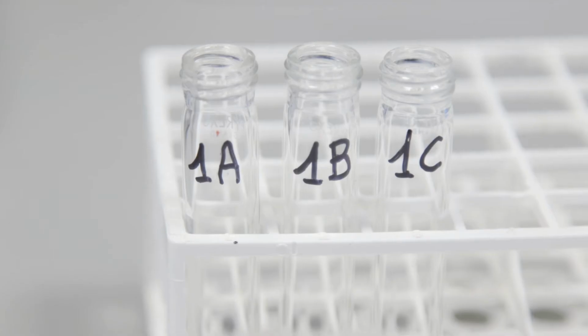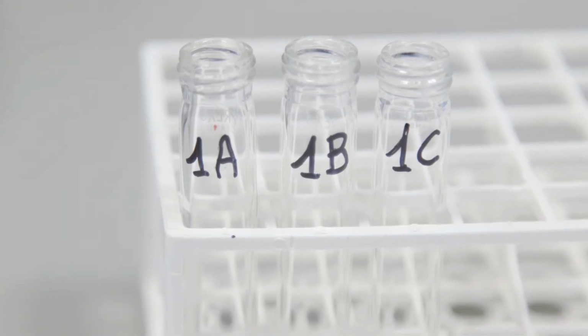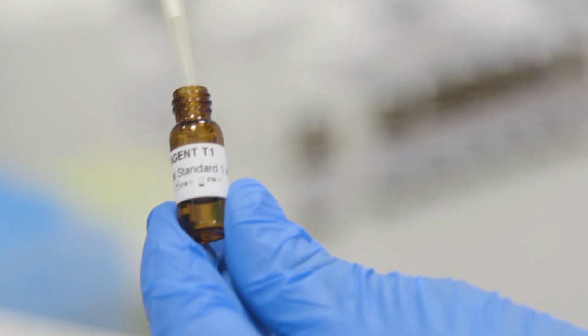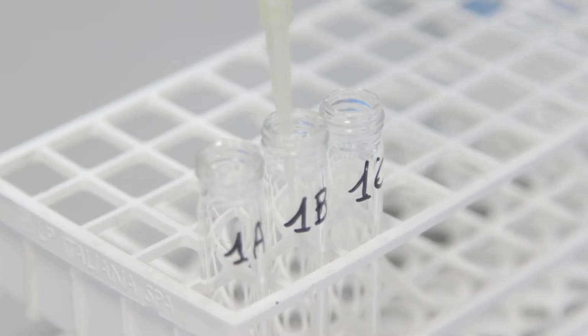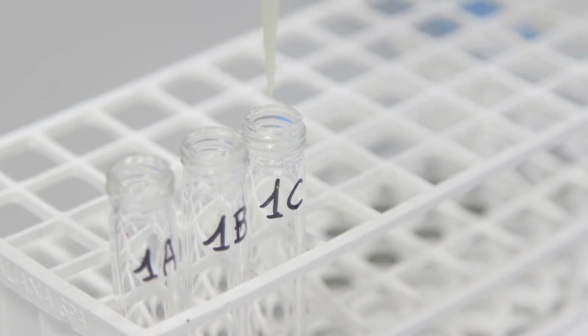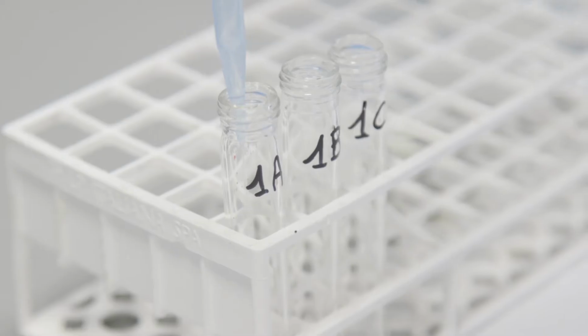At this point, you can proceed with the preparation of calibrators on 6 levels by successive enrichments. You have to prepare 3 glass test tubes. Name them 1A, 1B, 1C, and dissolve each chemical standard contained in the kit, T1, T2, T3, with reagent A, diluting solution, as reported in this table.